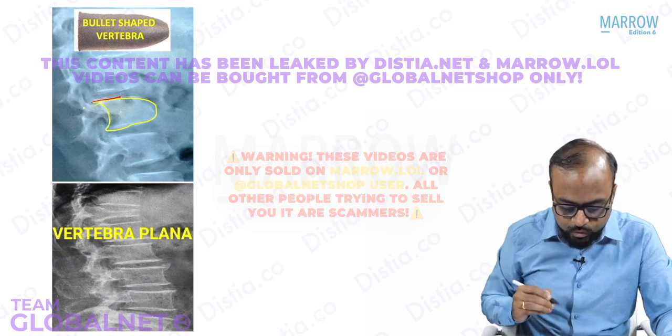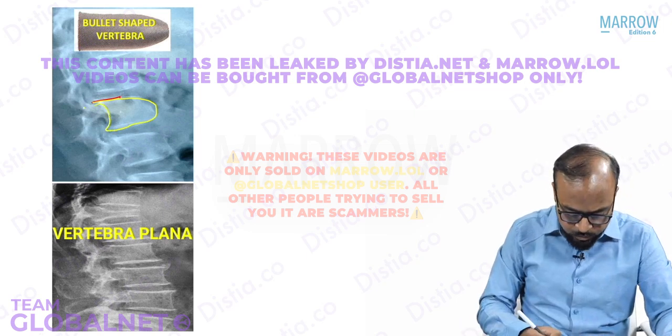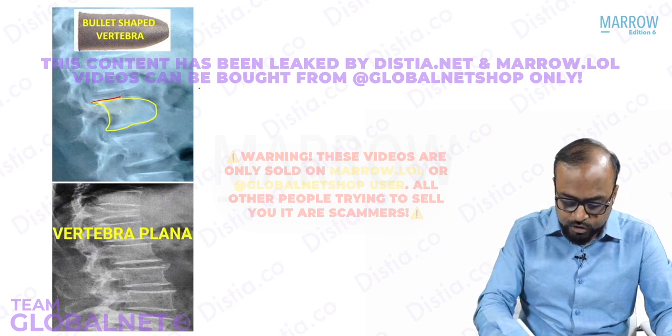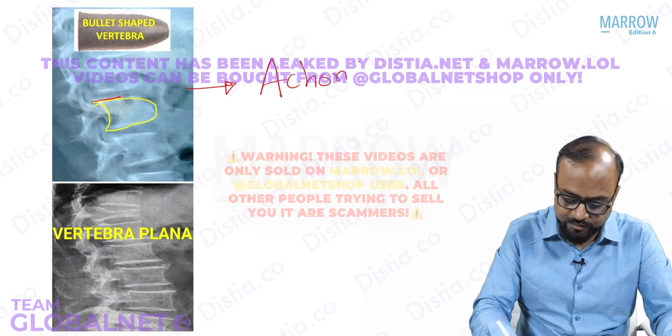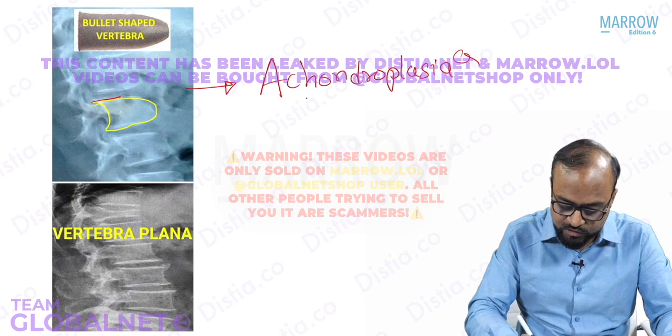So this is what is called a bullet-shaped vertebra. This bullet-shaped vertebra is actually a feature of a skeletal dysplasia, that is achondroplasia. We will discuss a few other features of achondroplasia as we go ahead.